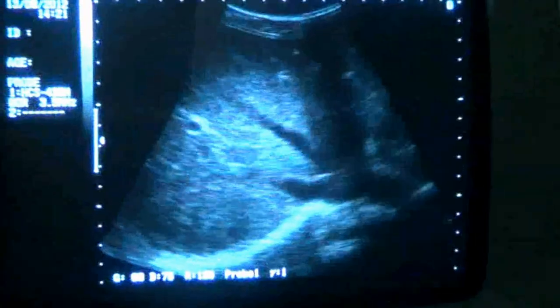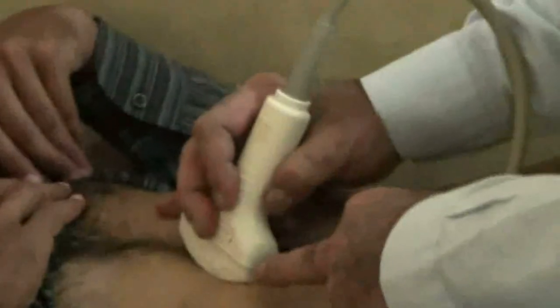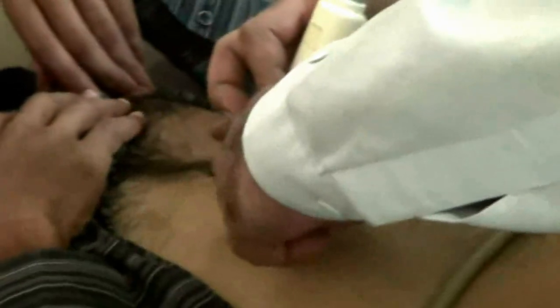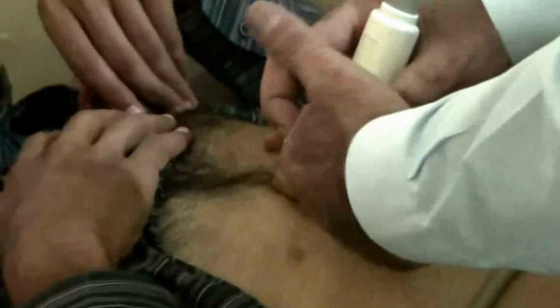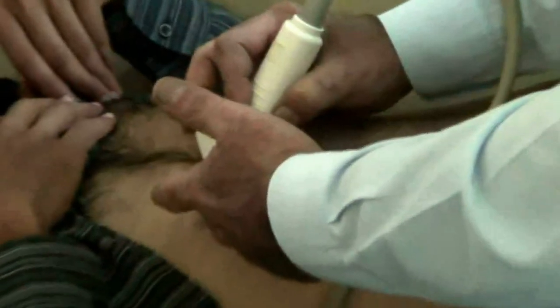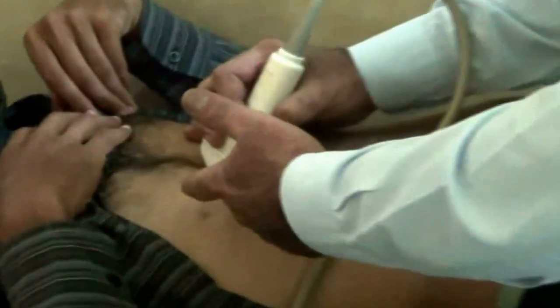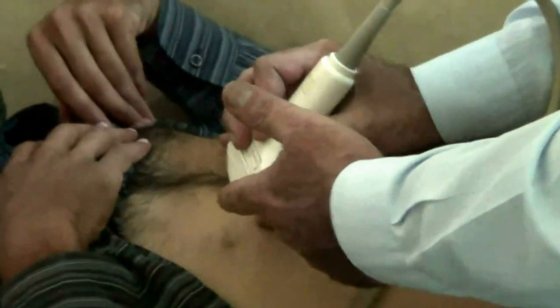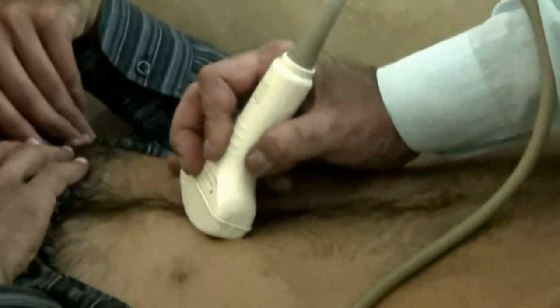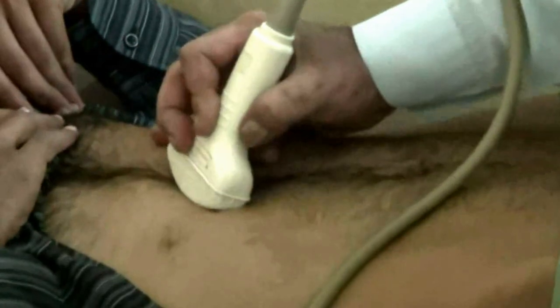Here you are seeing two hepatic veins when the probe is kept in this direction — below the costal margin, a little above the xiphoid process, just hanging it upwards towards the patient's right shoulder, and then maneuvering it from 60 degrees up to the 11 o'clock position.